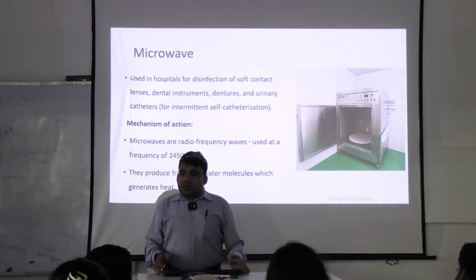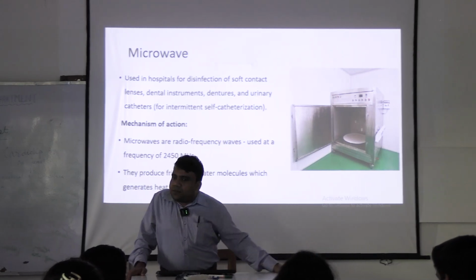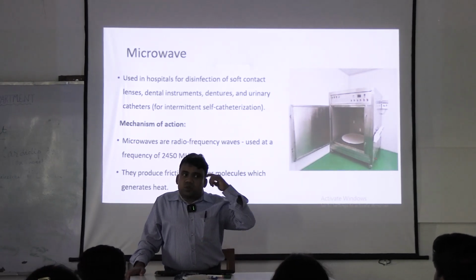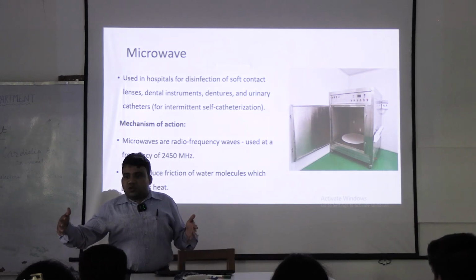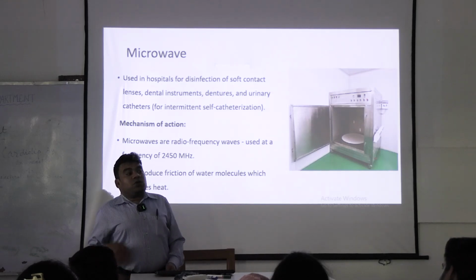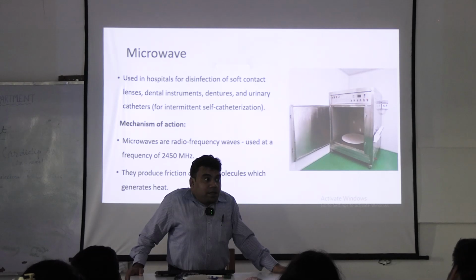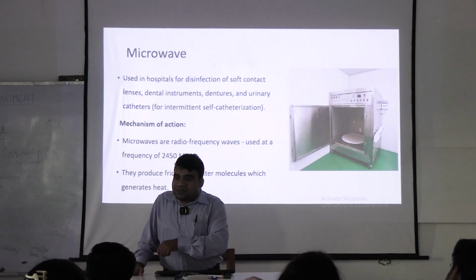Okay, ETO is a very good method, but again, the laparoscope has to be reused every time. So, can we use that? Most of the hospitals will not have an ETO sterilizer for that, because the instrument is a large instrument, and the ETO machine generally caters for small ones. So, what do we need to do? We need a chemical method of sterilization.